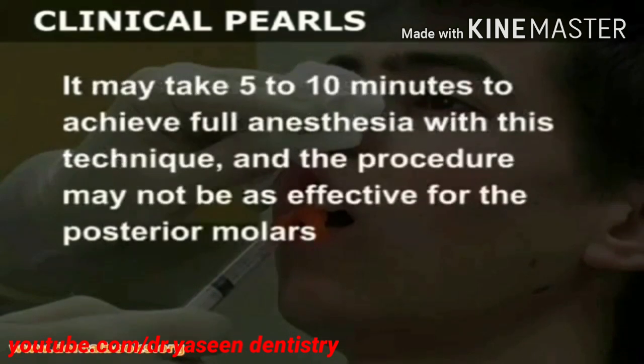It may take 5 to 10 minutes to achieve full anesthesia with this technique, and the procedure may not be as effective for the posterior molars.